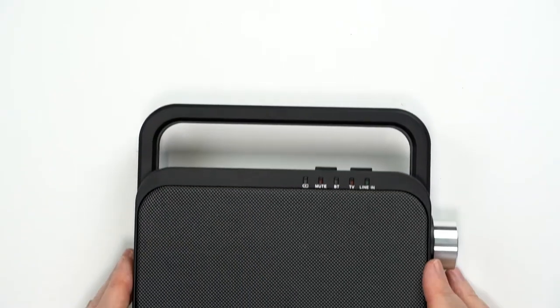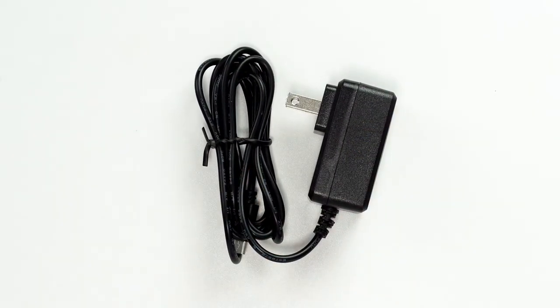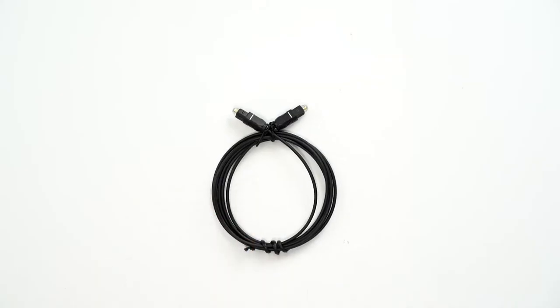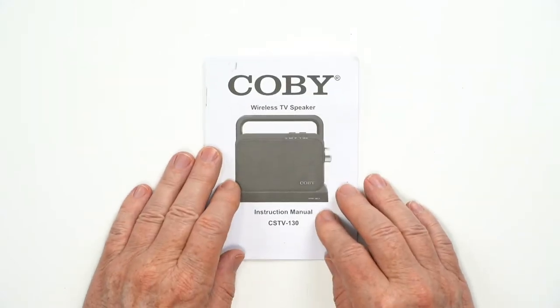In the box is the Wireless TV Speaker, a charging base, a wall adapter micro USB charger, an optical cable, auxiliary cable, a micro USB charging cable, and the user manual.